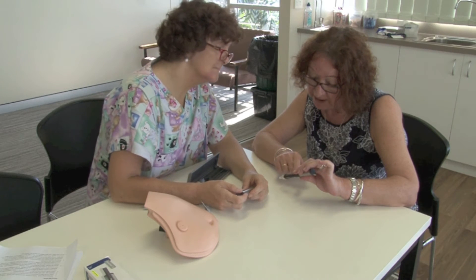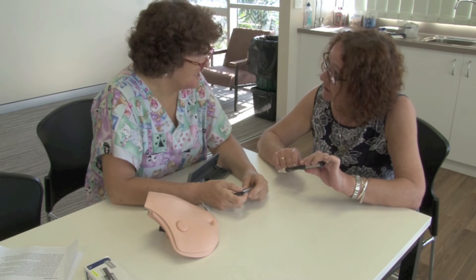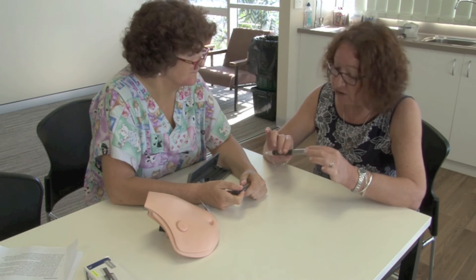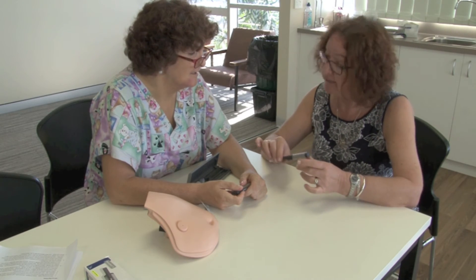Oh, and this is telling me how much liquid I've got left? Yes — units. So we measure your insulin in units. Oh, so that 12 that I'm on, that's units? Yes. Lovely, thank you.